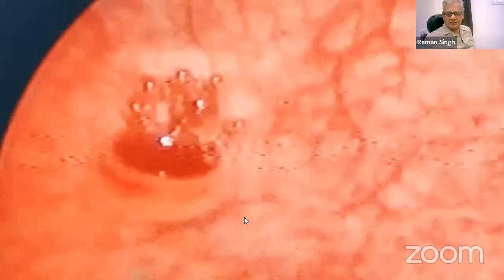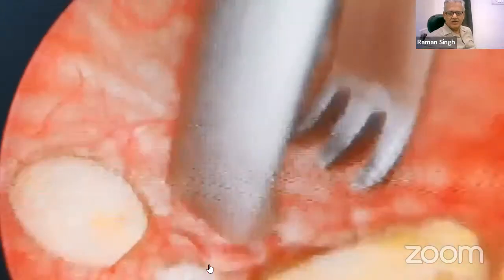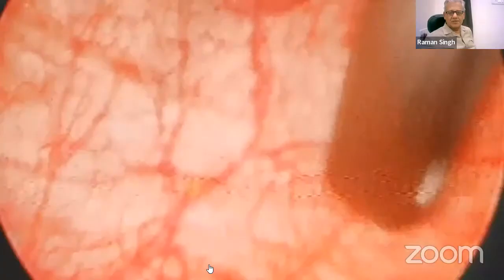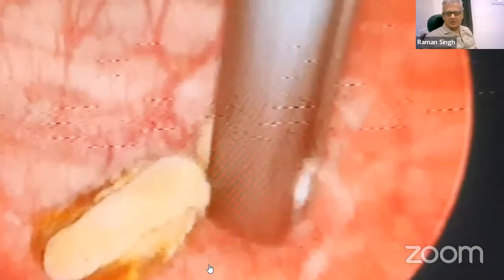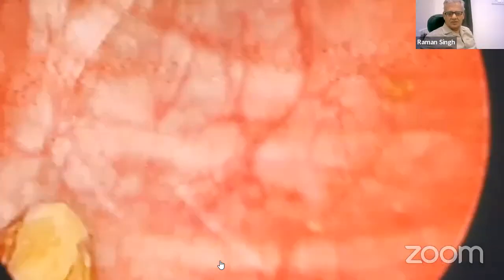So I had only laparoscopic instruments and did not have much urological instrument. There is no lithotripter. And the big stones, I thought how to remove them. Gradually one idea came to my mind, and in the suprapubic region I introduced a 10 mm trocar. After introducing the trocar, through that trocar I introduced the gallbladder extractor, and gradually I picked the stones one by one with the help of the grasper. And we also did this urological surgery.